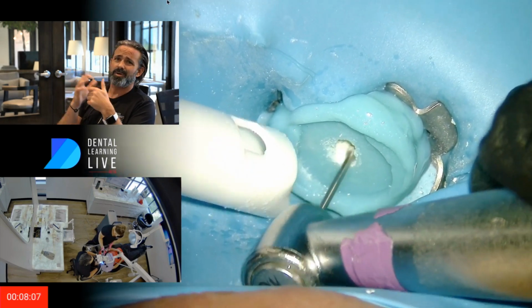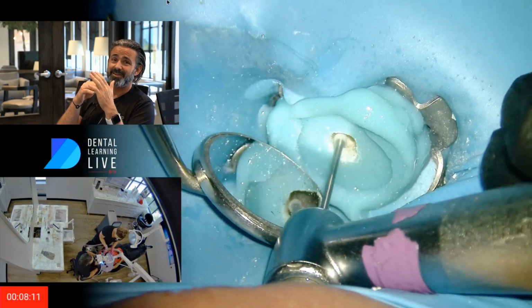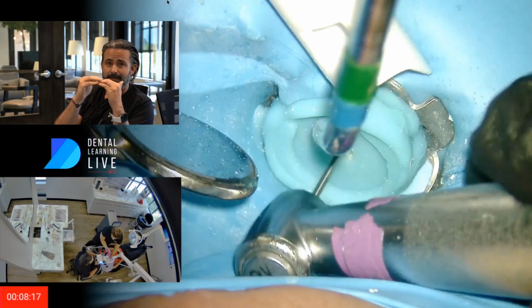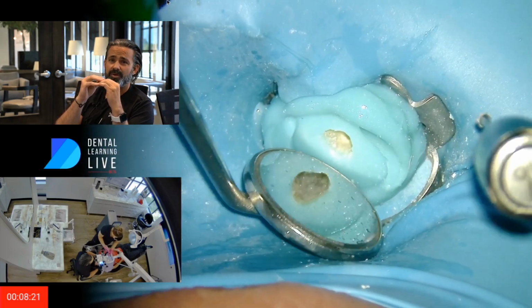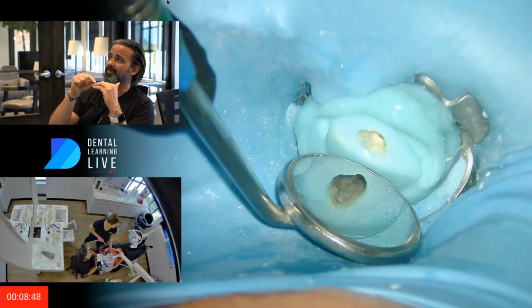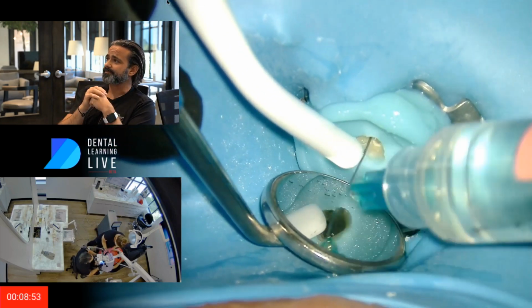I'm just taking a round burr, nothing special, but I'm checking that interface from where the tooth and the Sound Seal are married, and that butt joint, that margin, that connection, if you will. I want to make sure there are no voids and nothing is going to dislodge or happen in there. So I'm just taking a round burr and going around like I'm a router, looking at that interface.